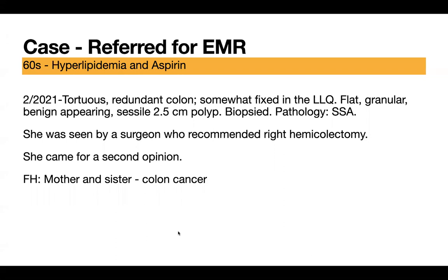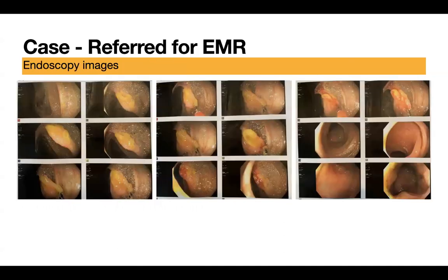She was later seen by a surgeon who recommended a right hemicolectomy, and she decided to have a second opinion. Family history is positive for colon cancer. Mother and sister dealt with colon cancer. And here are the images. I may want to see the images here.